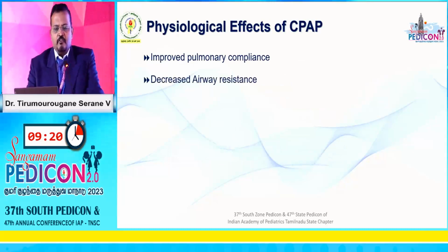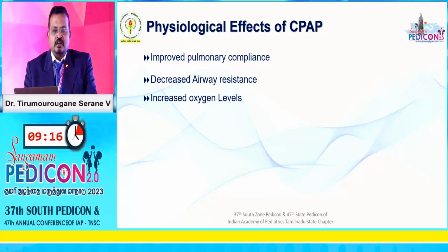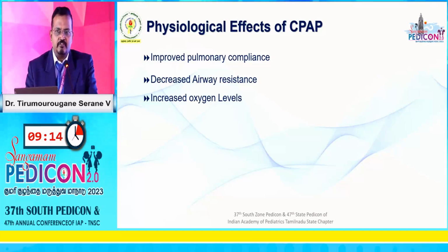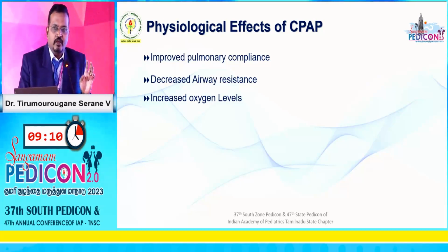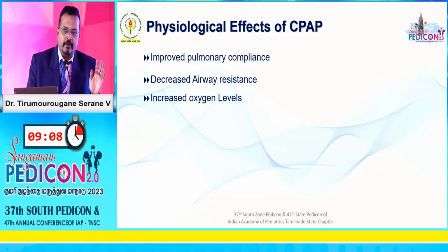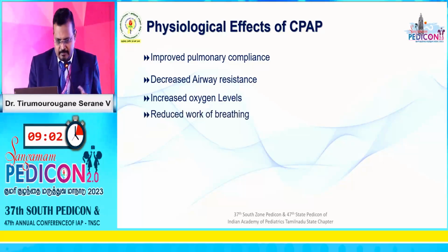The result of all this is that there is better pulmonary compliance, decreased airway resistance, and resulting in increased oxygen levels without giving oxygen. And the key point here is without giving oxygen. As I said, you always love to hate oxygen in a baby. So, we are achieving what we want to achieve without giving oxygen.